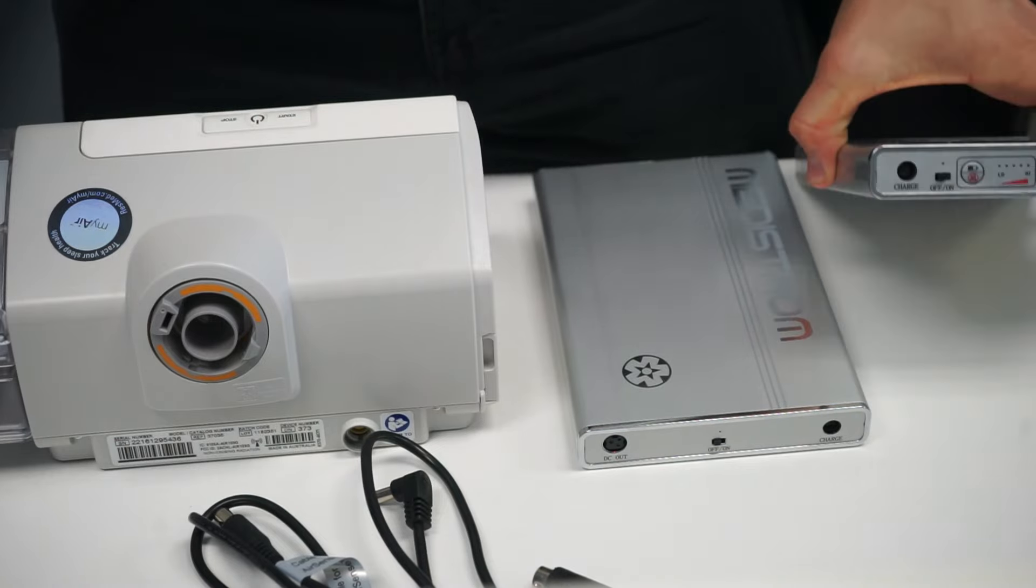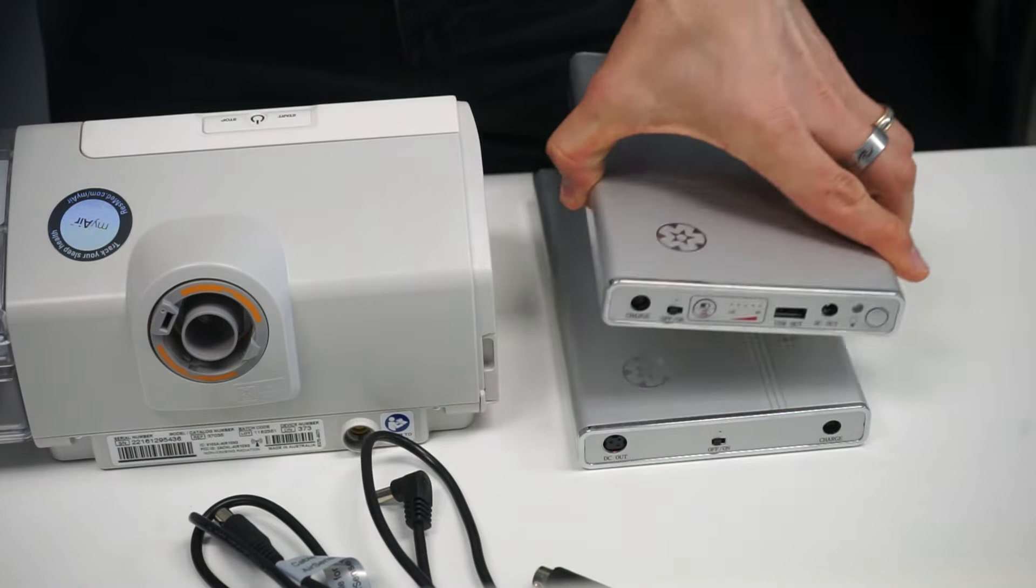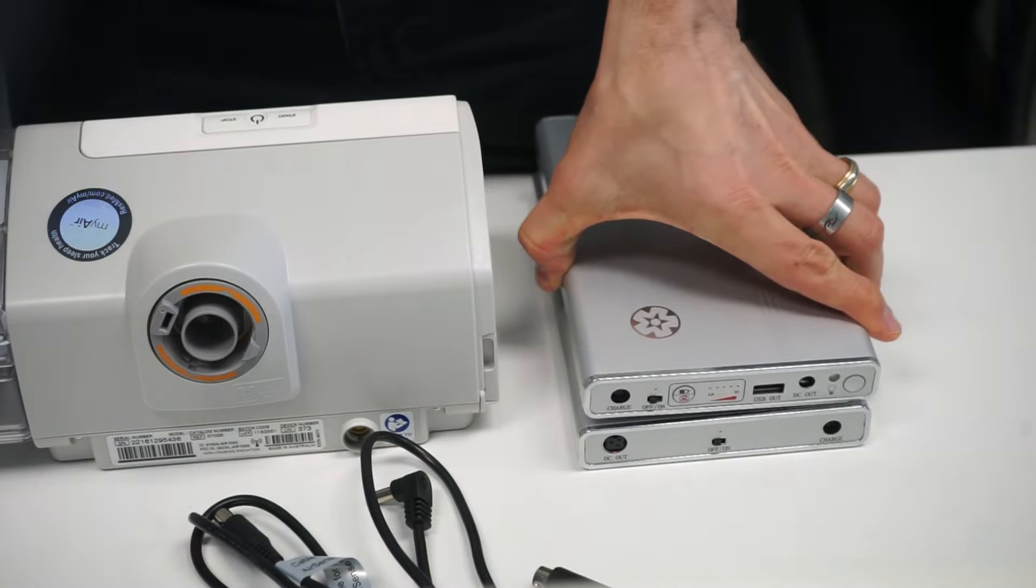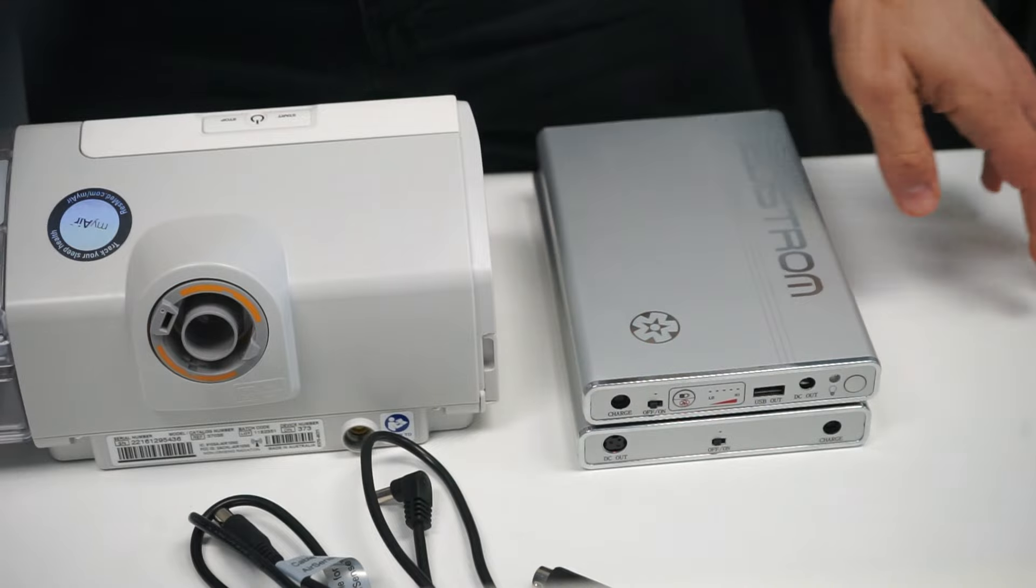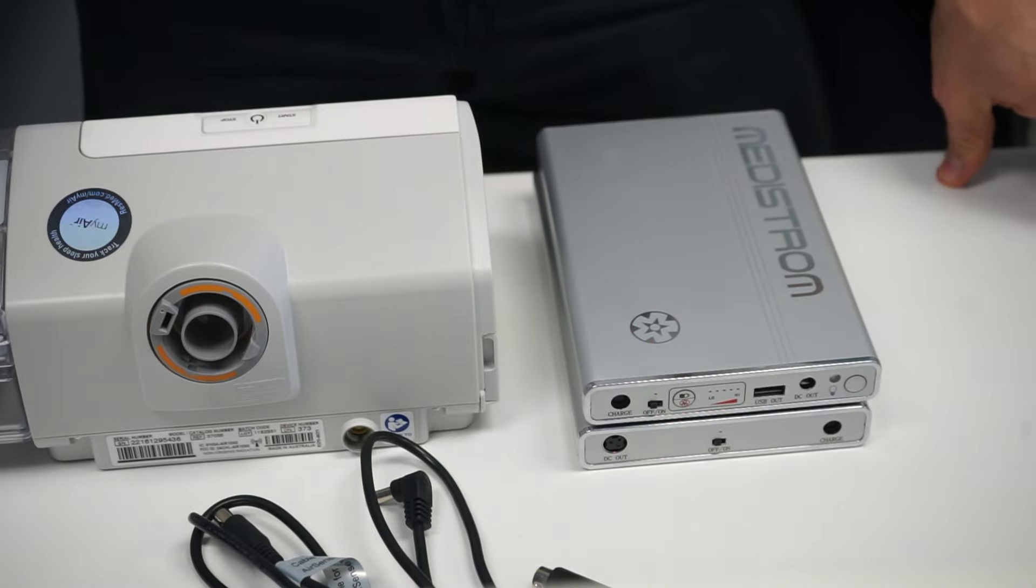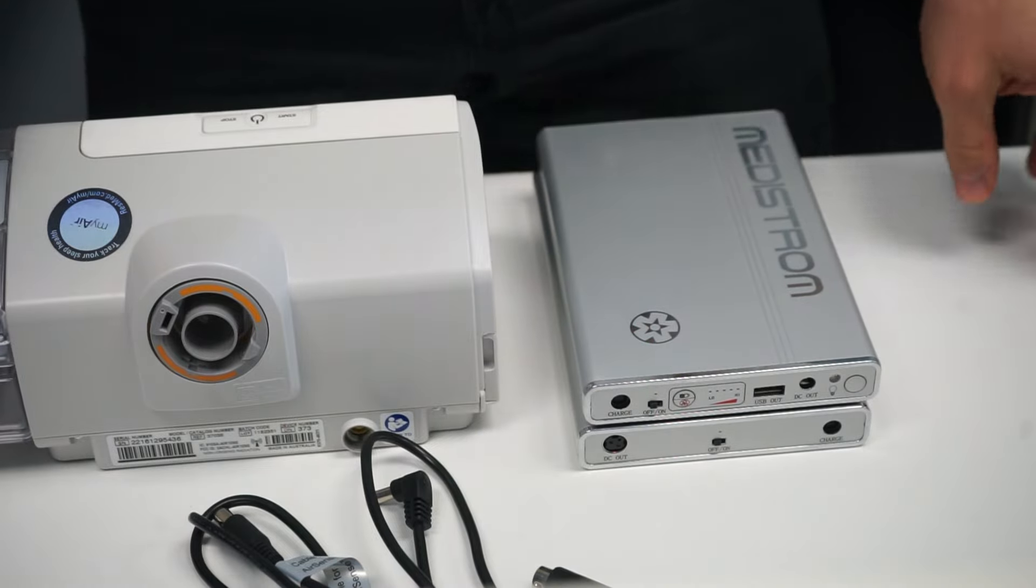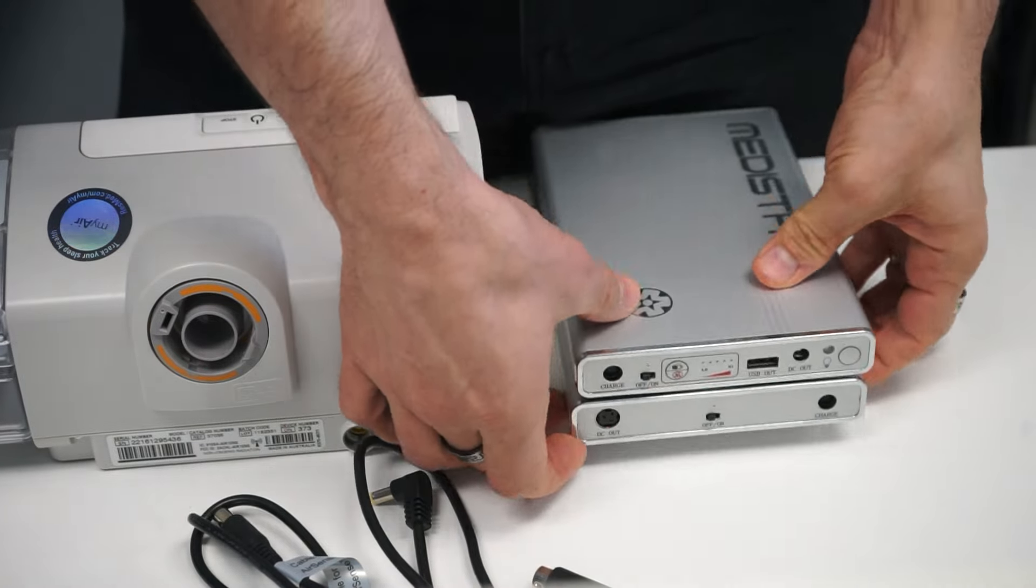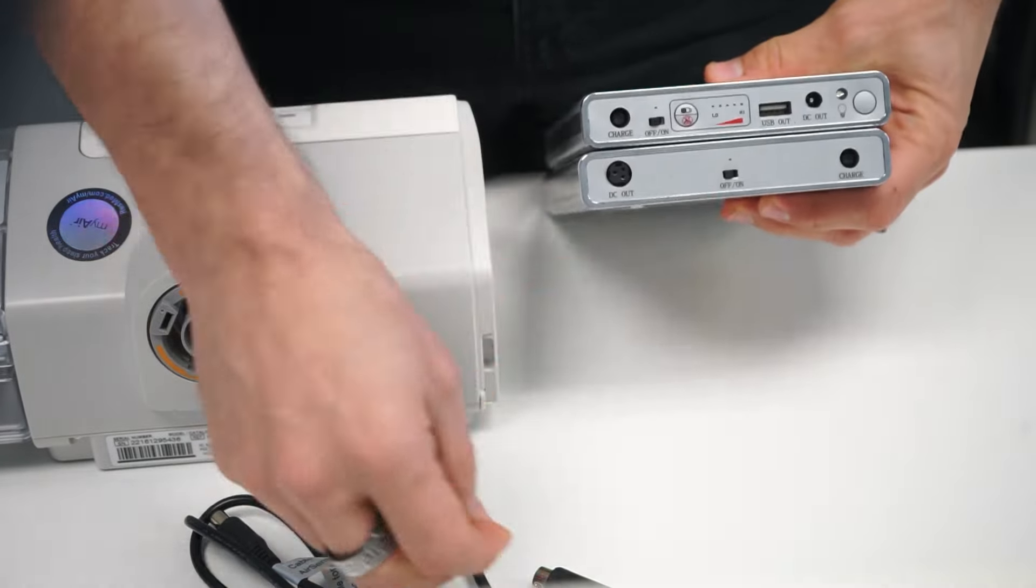First off, we're going to take the Pilot 24 and stack it on top of your Co-Pilot 24. Now there has to be a connection between the two.